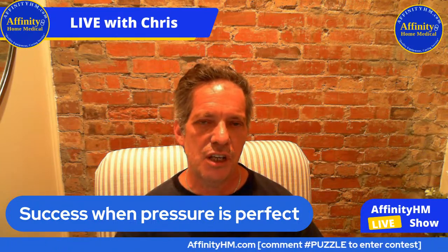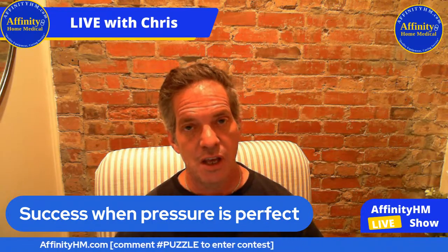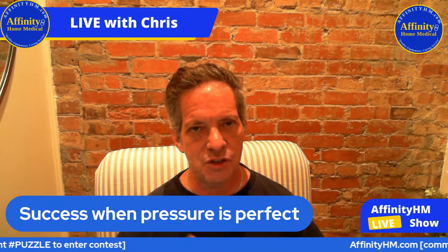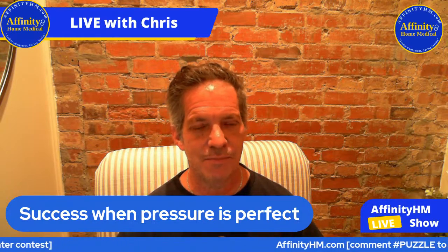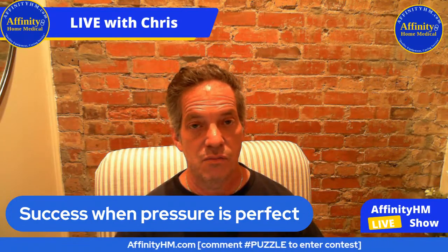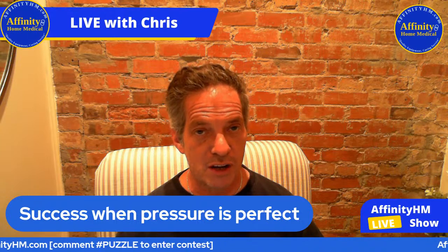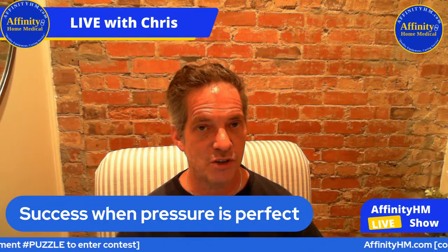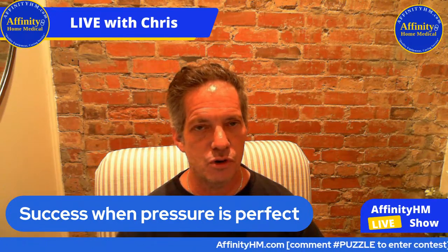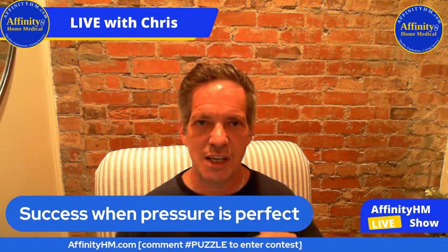I want to mention many CPAPs these days are actually APAPs. The difference between CPAP and APAP is this: a CPAP is just one pressure, maybe 10 or 12. The machine is going to drive that prescribed pressure whether you're breathing in or breathing out, and that's the amount of pressure you get all night long. With an APAP, we have a prescription that gives us a range of pressures, for example 6 to 12.